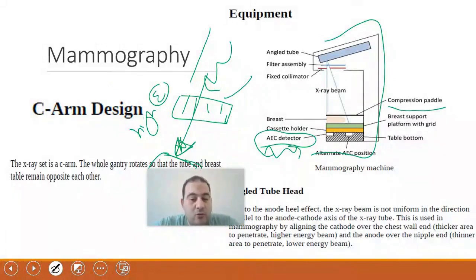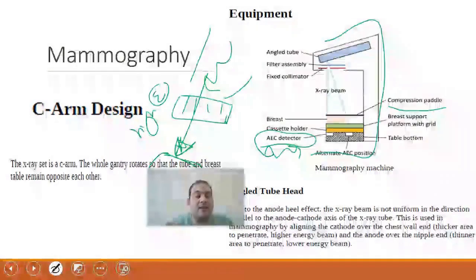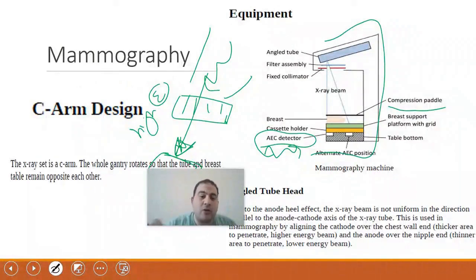This is supposed to be the one who comes to do the protocol. If I have a protocol for dense breast, usually breast protocols are the same and fixed, meaning the known values are almost constant, because you are using the specific target and the specific filter. So it starts to create these protocols and begins on the machine itself, stating that I want a certain signal to noise ratio.